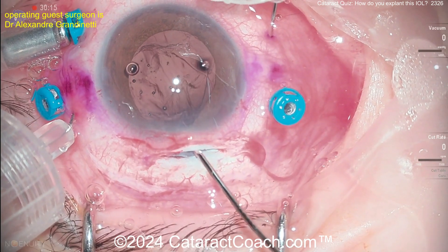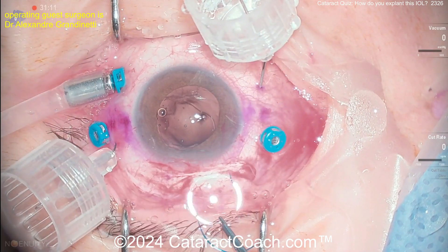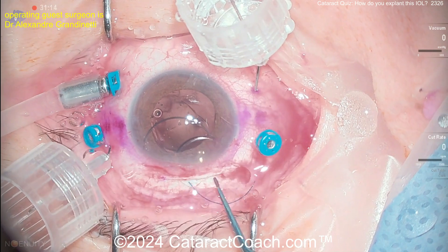Here's the capsular bag — you can pull that out of the eye as well. The surgeon is going to do the Yamani technique, so no need for any capsule remnants. Take your time doing a nice vitrectomy.